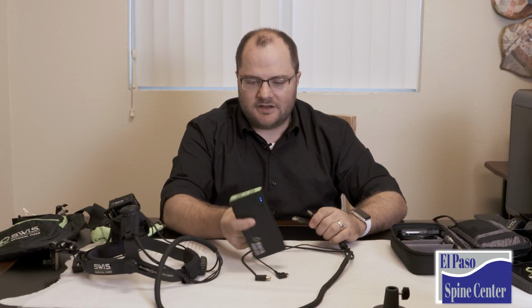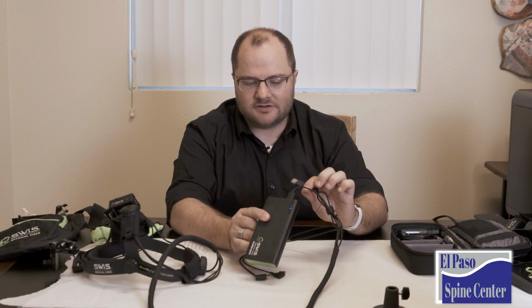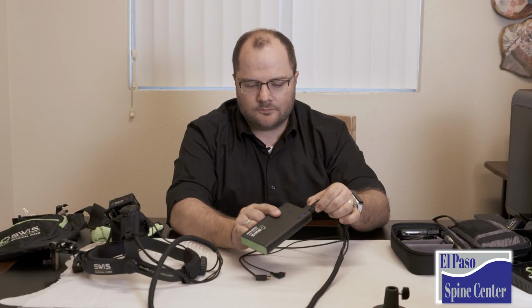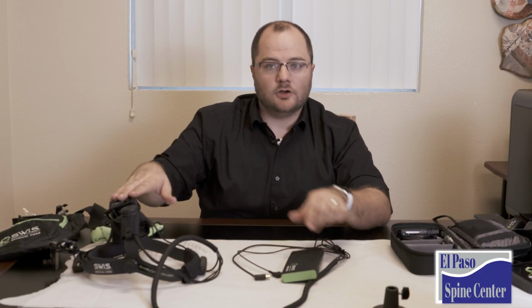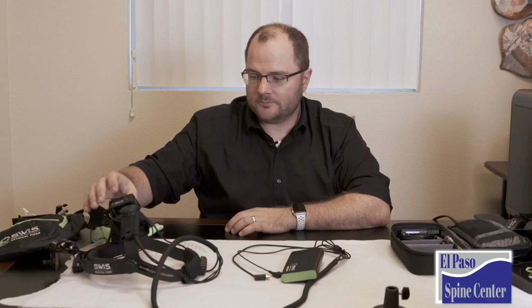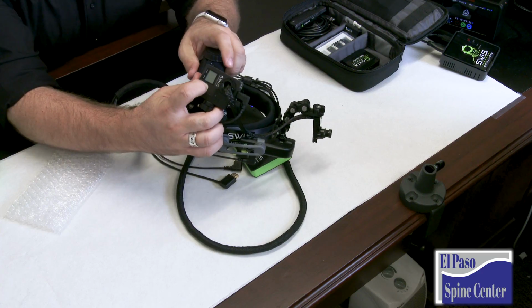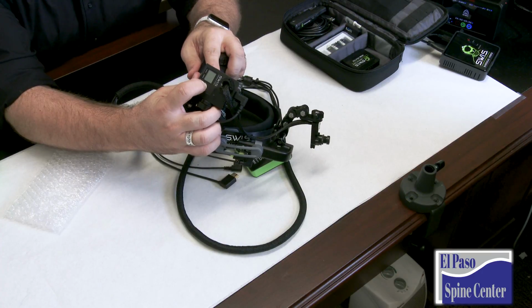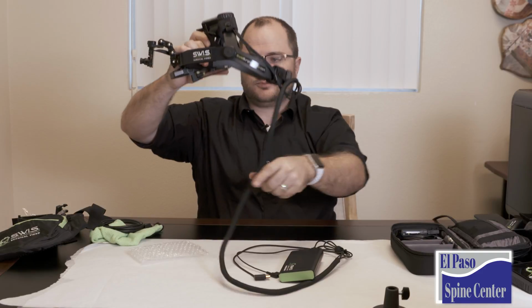So I'm going to take my USB cables, and those are just going to plug directly into my power supply. Now I have power to both the GoPro and the Viewfind. So I can go ahead and turn on the GoPro. The GoPro, if you haven't used them before, it's just holding down that front button. It'll beep, and it's already ready to record.